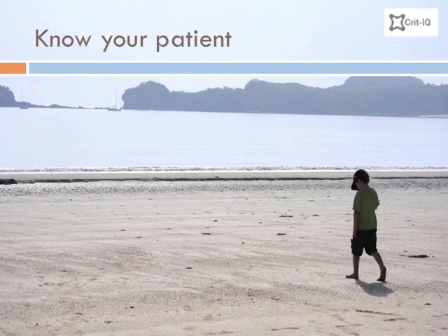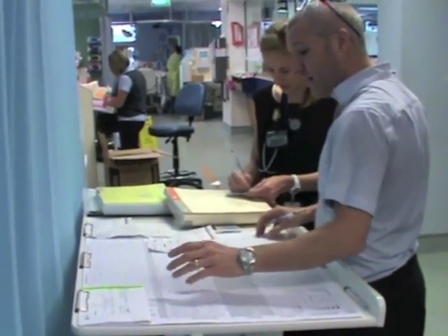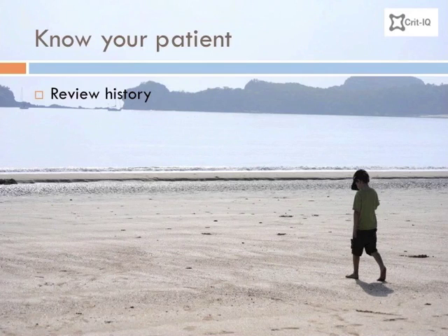Frequently, the critical care team that take the patient to another destination are not the primary team caring for them. It is important that you get to know the patient well enough before departure that you can plan for any misadventure. Review their history. If required, get a handover from the clinical staff looking after the patient. Know what has brought the patient to hospital, the progress so far, and how they've been managed.